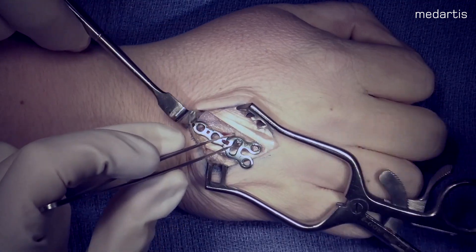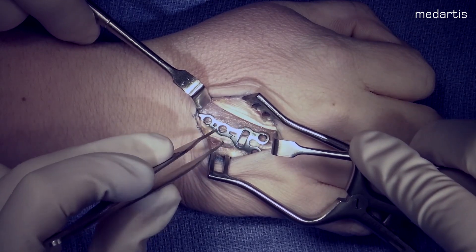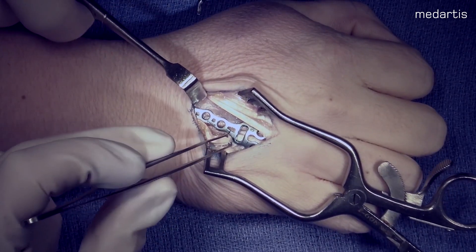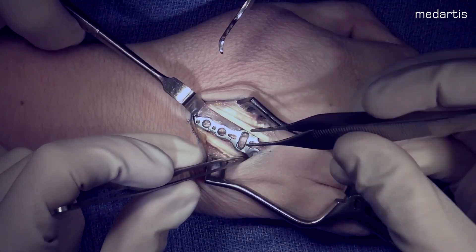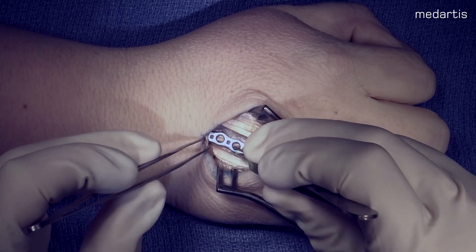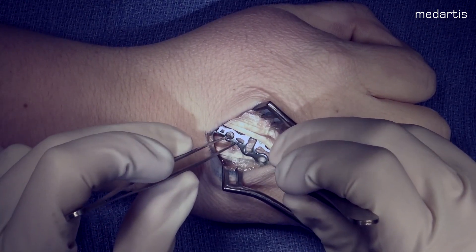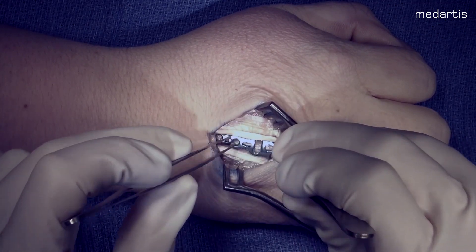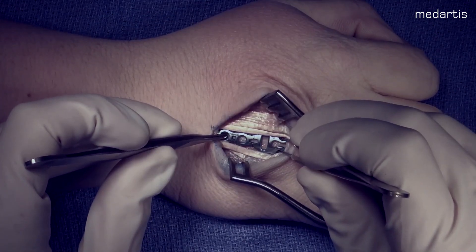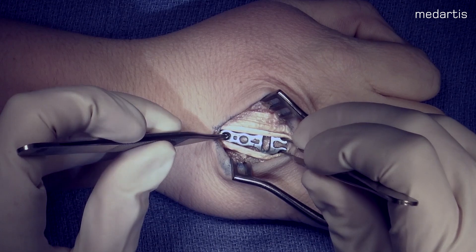Important aspects of the plate: the oblong hole should be placed close to the metaphysis for osteotomy placement. The oblong hole has the ability to place the screw either more radial or more ulnar depending on the rotation you're trying to correct. There's no need to fully tighten the screws at this point, and the low profile of the plate aids to minimize soft tissue irritation.